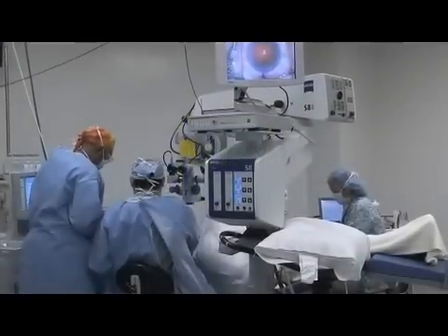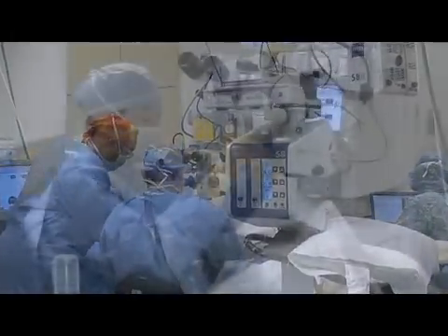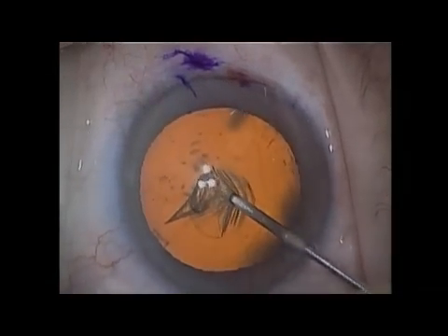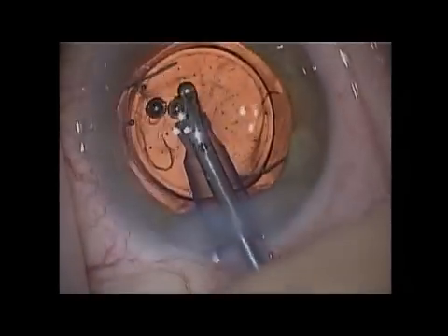Comparing the Lumera to what we've been currently using, which is the Vizu 160, it's surprising just how much of a difference this makes. It's really like looking at high definition TV for the very first time — things just jump out at you. And so going back to our previous microscope, the view is excellent, but you kind of find it lacking in terms of that high definition, just like going back to a regular television set.